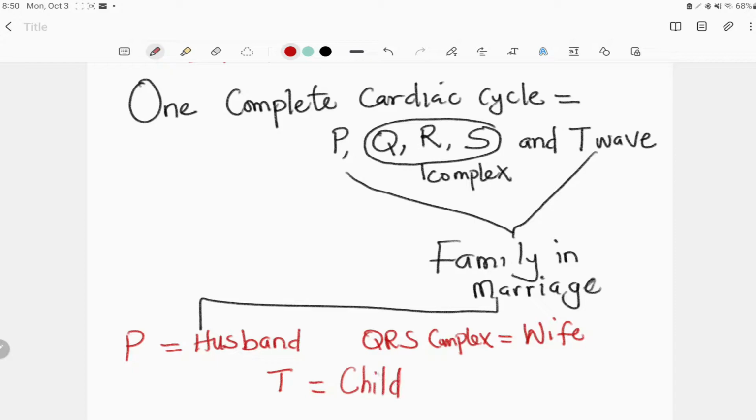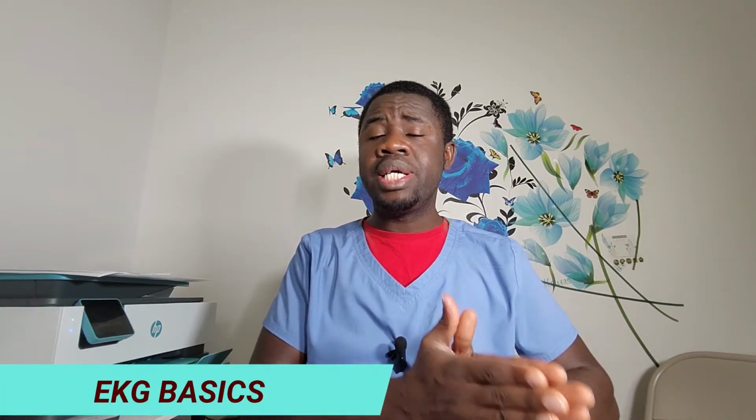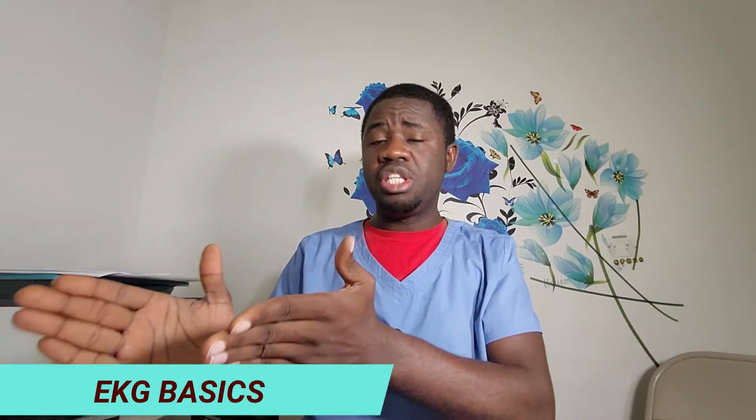These members of the family must always be together. Any separation among them can affect their marriage. So any separation in the waveform, for instance, if P is too distant from the QRS complex or the QRS complex is too distant from the T wave, that causes an abnormal rhythm in the heart.